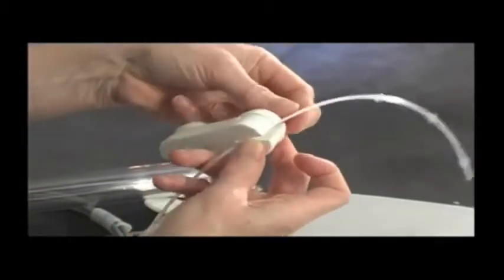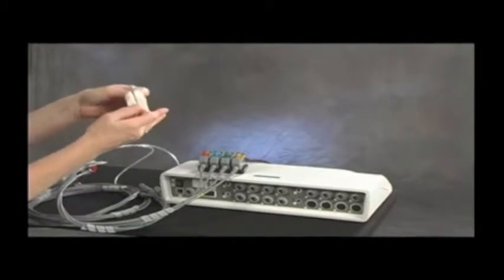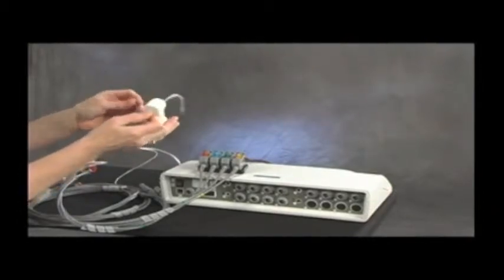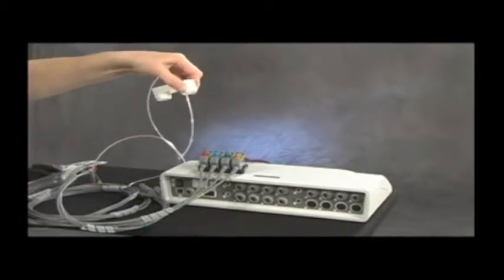Holding the white silicone cap, choose one of the 2 circular openings in the cap. The narrow opening is used for esophageal catheters as well as for the staggered anal-rectal catheter. The wide opening is designed for the radial anal-rectal catheter. Open the side of the cap by spreading the slit that extends lengthwise into the drilled opening. Gently position the catheter lengthwise into the opening so that it fits snugly against the inner wall.